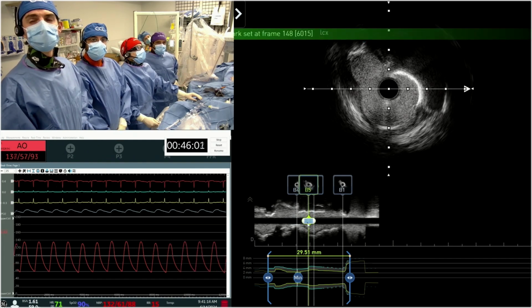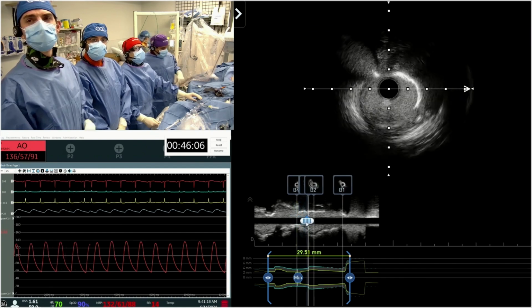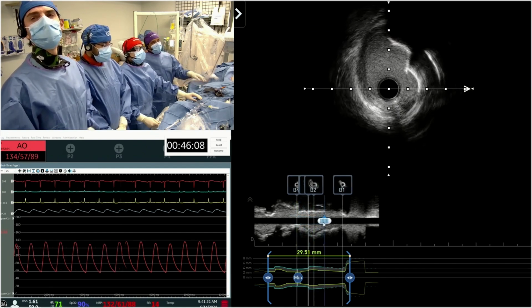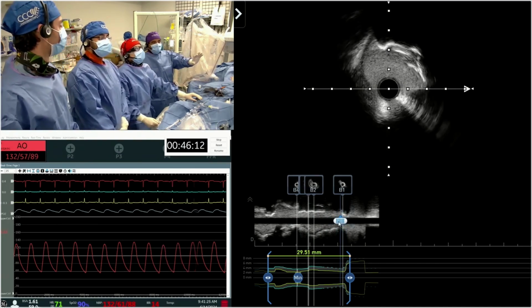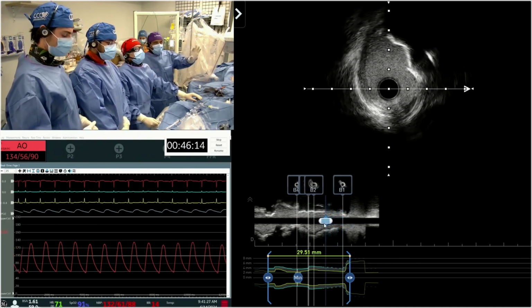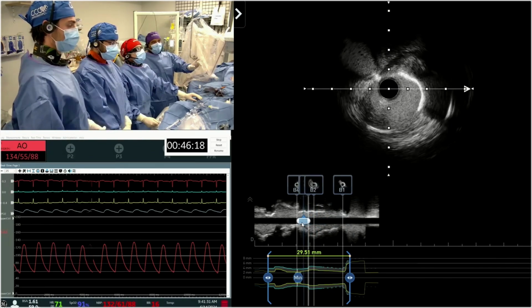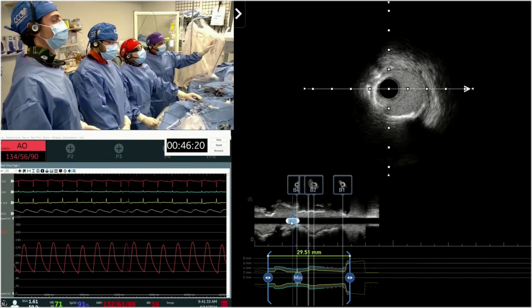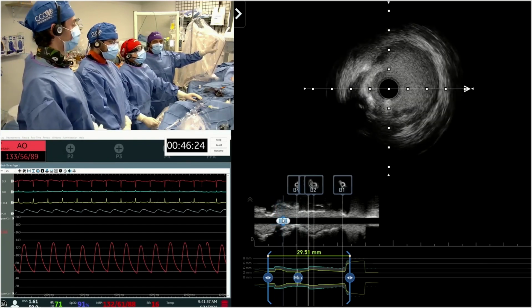Dr. Sharma, good morning. Yes, very good morning, my friend. Yeah, Praveen. So the question was, we felt that, taking all the factors together, age and so on, angiographically, and indirectly, not without doing the ostial circumflex, we said that probably we need to just work more on the left main and LAD. And let's go back to the angiogram.